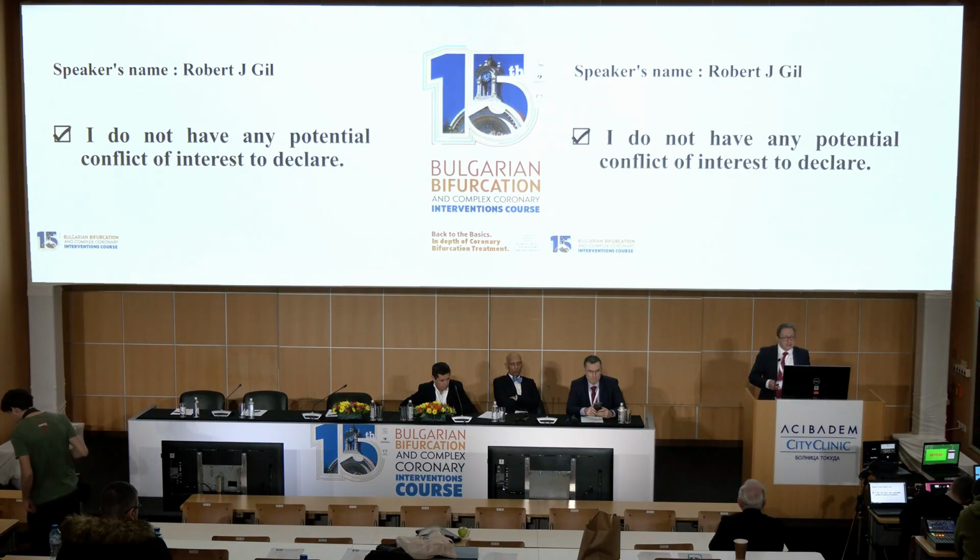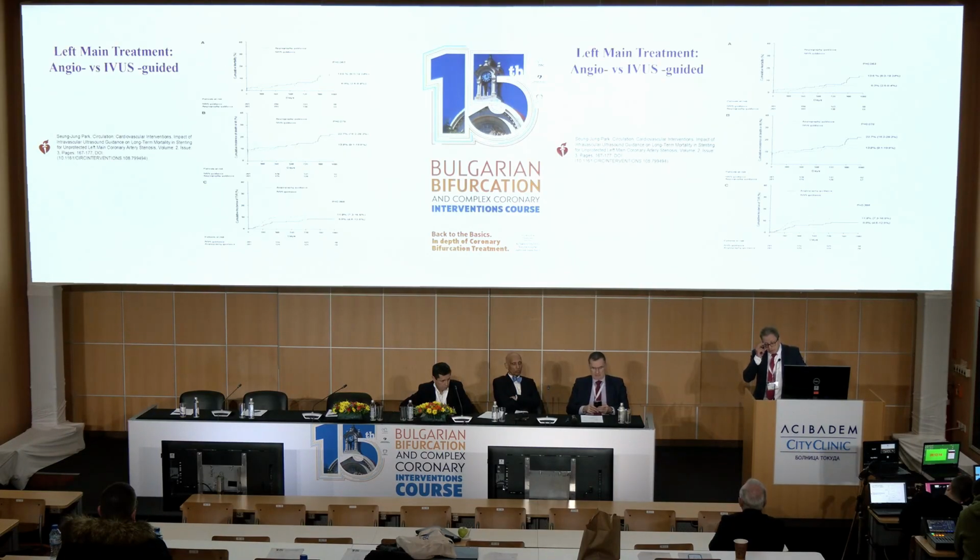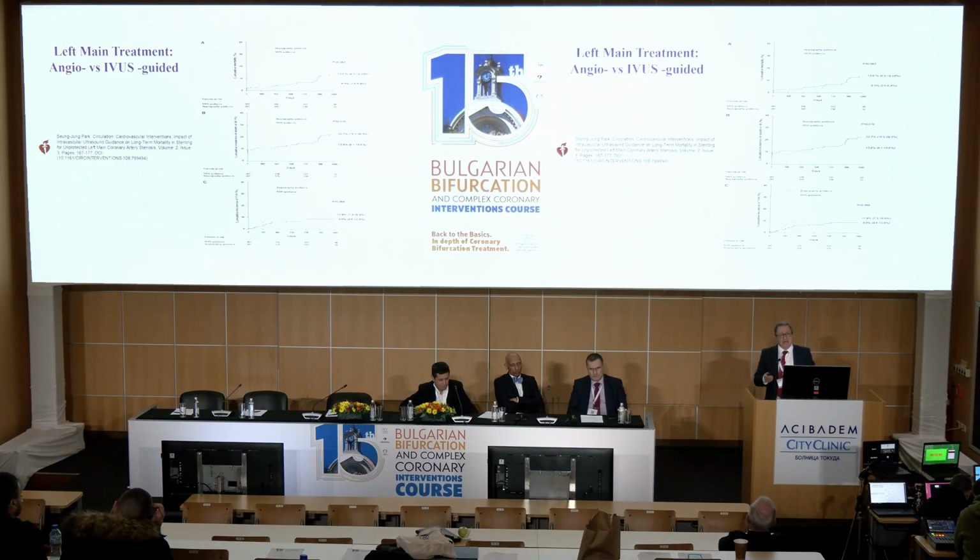I don't have any potential conflict of interest with this particular presentation to declare. However, I am still an active interventional cardiologist, busy with intravascular imaging since the beginning of my career. That was really many, many years ago. And I would like to start my presentation with this slide showing the first slide showing that IVUS guidance can really improve the results of percutaneous treatment for left main.